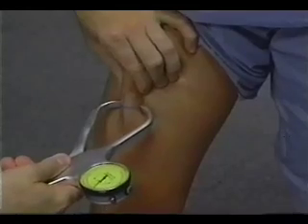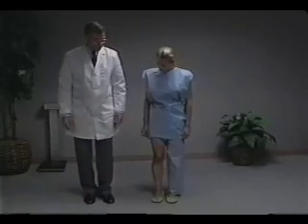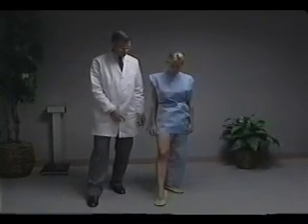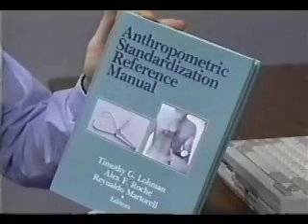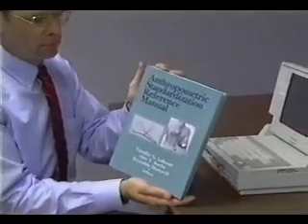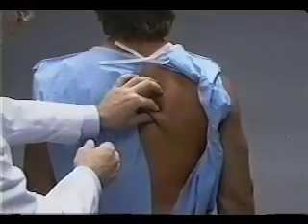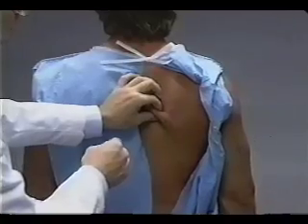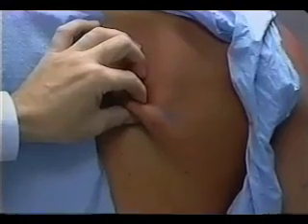It's intended to share with others the specific procedures selected and used for the anthropometric assessment. The viewer should have a basic knowledge of the fundamentals of anthropometry. For further background information on the underlying principles of anthropometry, as well as distributors of measuring equipment, a reference such as the Anthropometric Standardization Reference Manual is recommended. This demonstration will allow others to follow the NHANES III anthropometric methodology and will enable comparisons of data from other studies with national reference data.